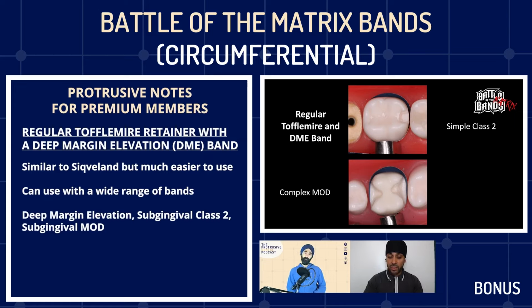And DME seems to be quite the trend at the moment as well, of raising your margin in order to place either a direct restoration or an indirect restoration. But it seems to be very, very trendy at the moment, right? People are moving away from subgingival crown margins, right? It does need setting up, but again, it's easier than the Siqveland.